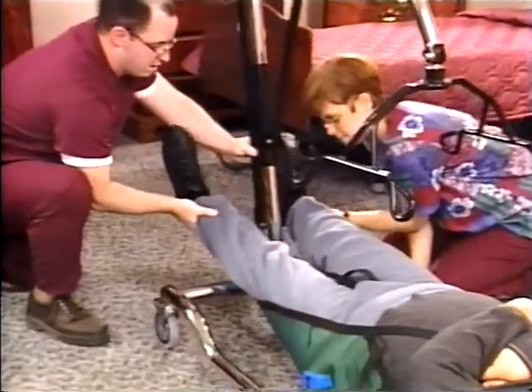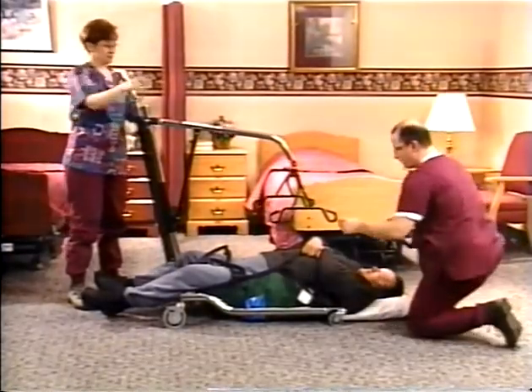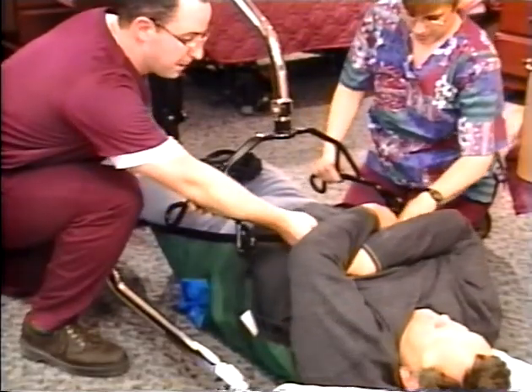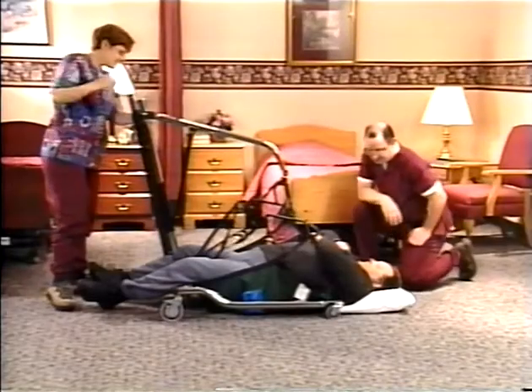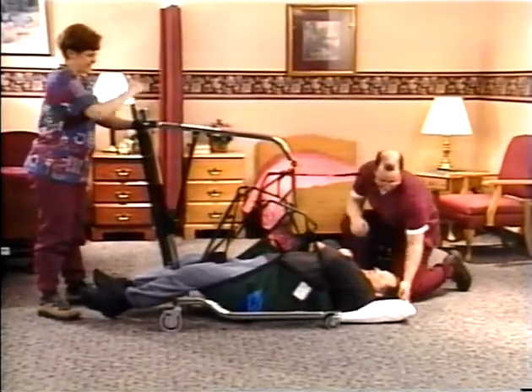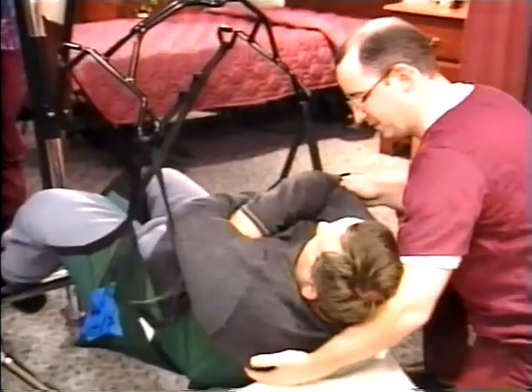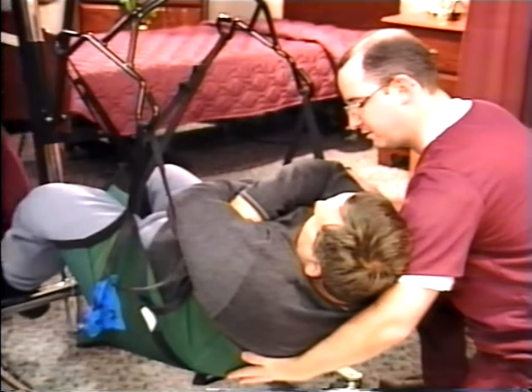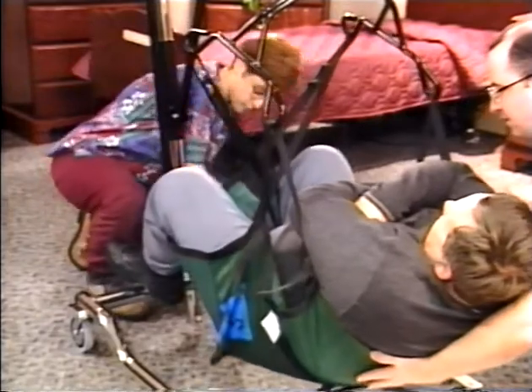Center the boom over his midsection as closely as possible. Now lower the cradle until the sling loops reach the cradle hooks. Raise his knees and attach the sling to the cradle. Lift him gently and turn him to face the caregiver. As one caregiver uses the controller to gently raise him, the other checks to see that all loops are properly secured. Whenever possible, place his feet on the base and keep the cradle low for a smooth, secure ride.